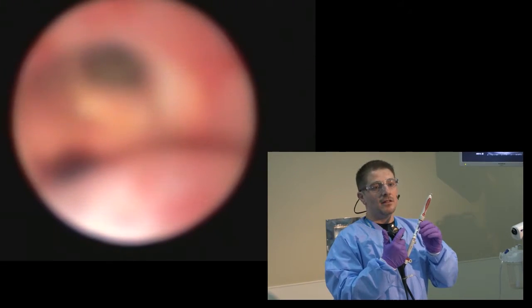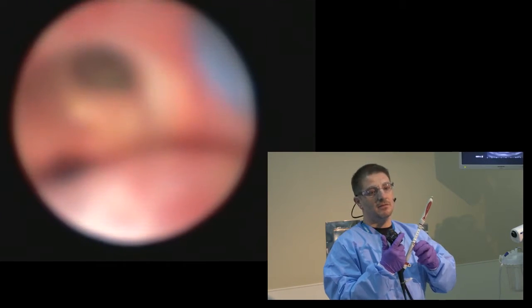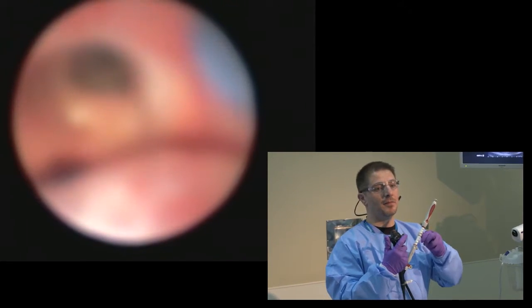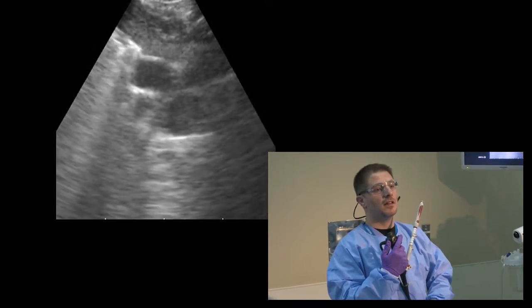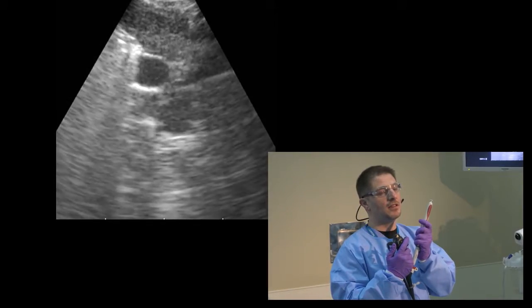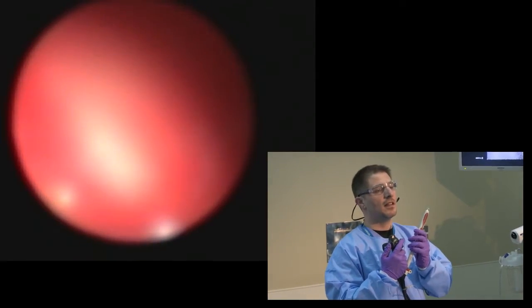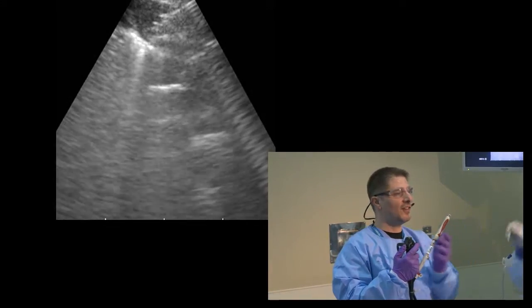You put your needle, you set up the sheath and you lock it. You go in the left lower lobe after setting the depth and you touch the carina wall and you see now the lymph node 11L at that location. You push the needle and you see the needle now inside the lymph node. And you do the, can you pull this halfway?